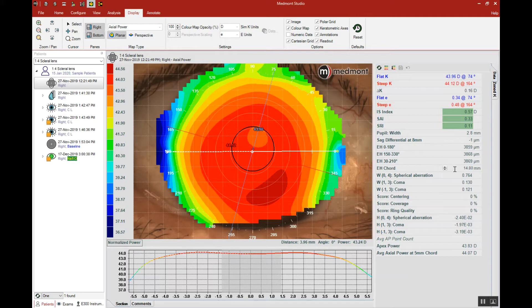The next step is to choose the chord of contact that we want to select. For example, if I use a 16 millimeter scleral lens that measures its sagittal depth to 16 millimeters, that's the number I'll enter here. The first question you need to ask yourself is: what chord diameter does your scleral lens measure its sagittal depth? Is it from edge to edge, the total diameter of the lens, or is it to the point of greatest bearing? Some designs choose their sagittal depth from the middle of the alignment zone where the lens lands with all of its pressure.